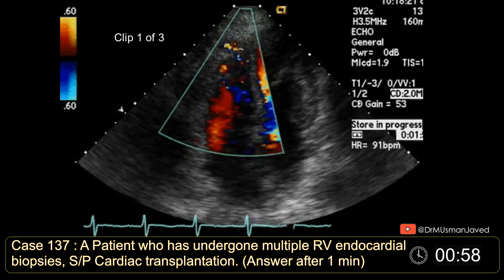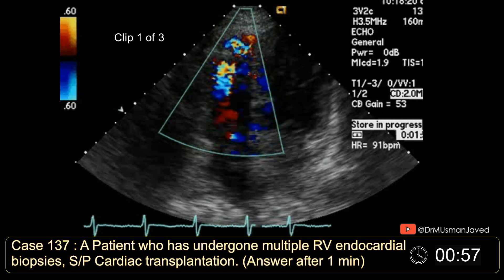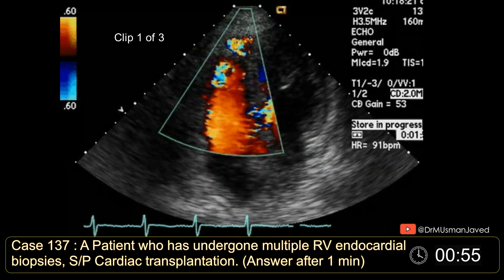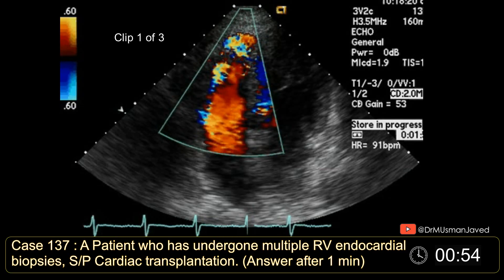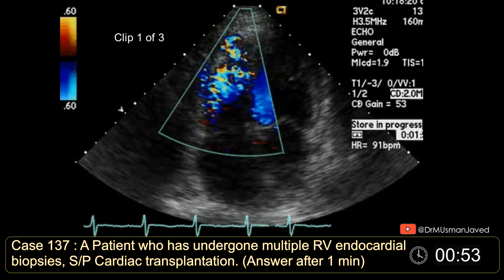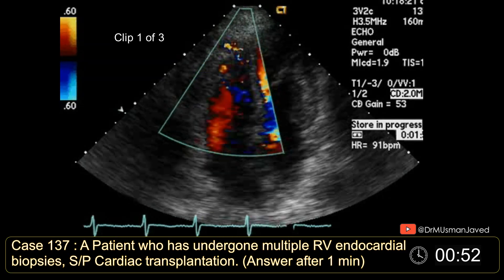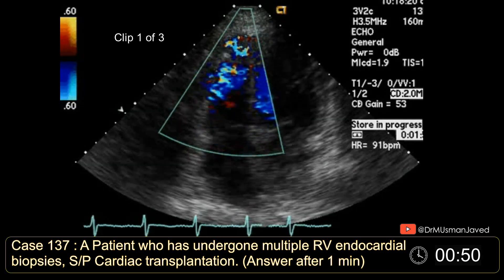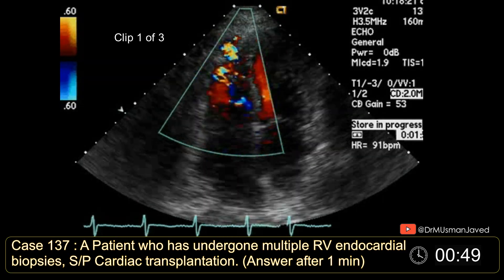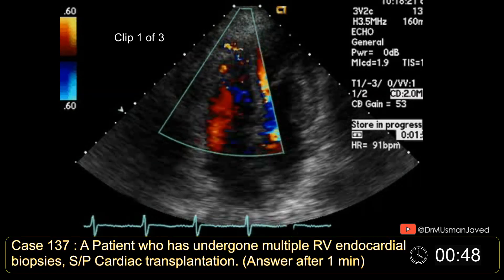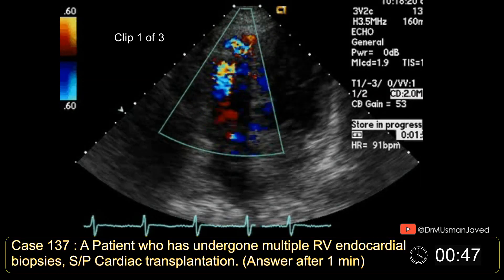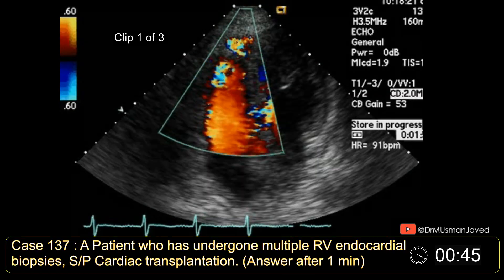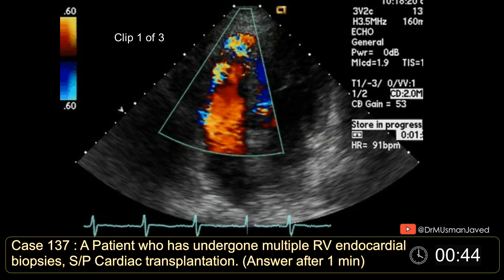Welcome to another echo case. This case is of a patient who had cardiac transplantation and has undergone multiple right ventricular endocardial biopsies. Try to spot the findings and likely diagnosis.